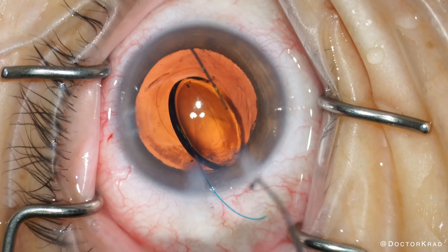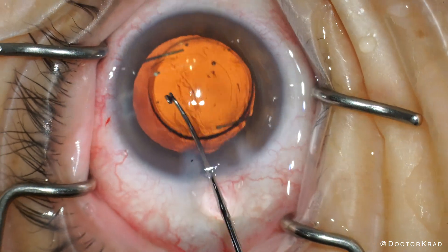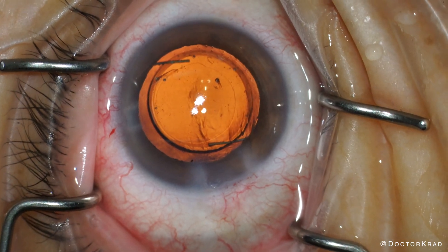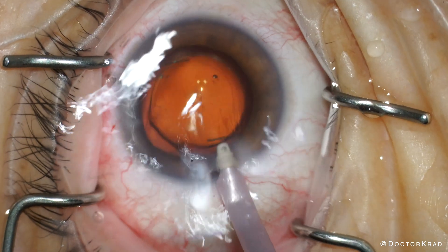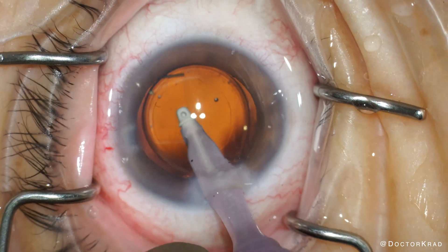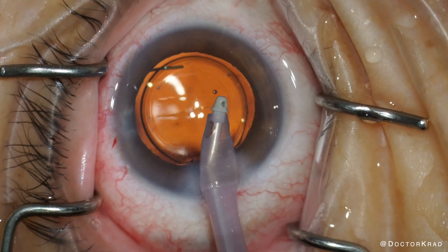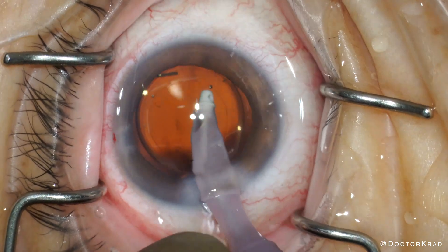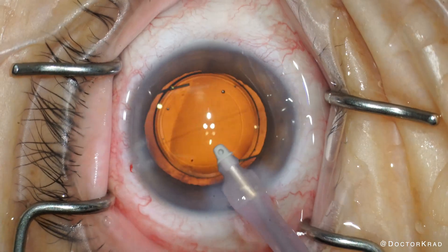So my first impression with this new injector system is that it may be easier for a new technician to load it, but delivering the lens into the eye is very similar, if not the same, as the previous injector. I wish the lens would come out in a more planar fashion — more precise as you release it into the eye. It needs to be so precise that you can comfortably put it in the sulcus if you wanted to. You need to be able to put it in the eye in a very precise and controlled manner. You can teach someone how to load a lens, no matter how nuanced it is, but that lens needs to be deliverable into the eye in a precise and controlled way.